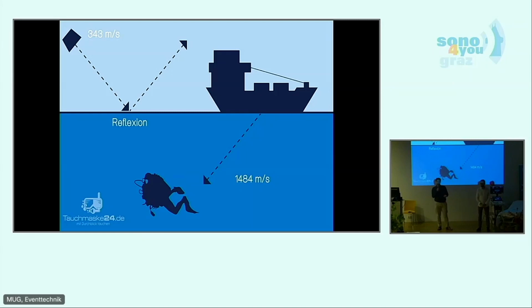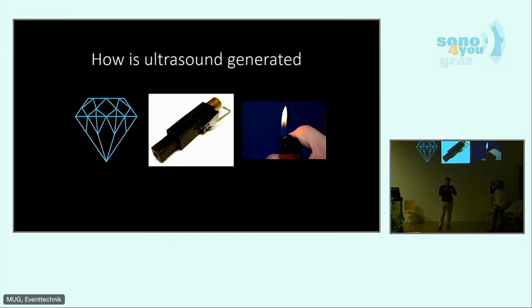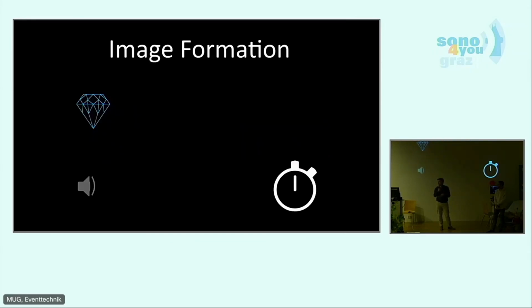So now we already know how sound waves behave inside of the tissue. Now we need to know how sound waves are actually generated. You all know that principle from your lighter, because an ultrasound machine is based out of crystals and out of a stopwatch. And we start with the crystals now. They are actually in your lighter, and when you press the button, you all know a flame is coming. This works in both directions. So if we apply an electrical current to a crystal, it starts swinging and it's emitting an ultrasound wave. But if an ultrasound wave comes back to the crystal, again it's swinging, but now it is emitting an electrical current. And you can see that on the next slide.